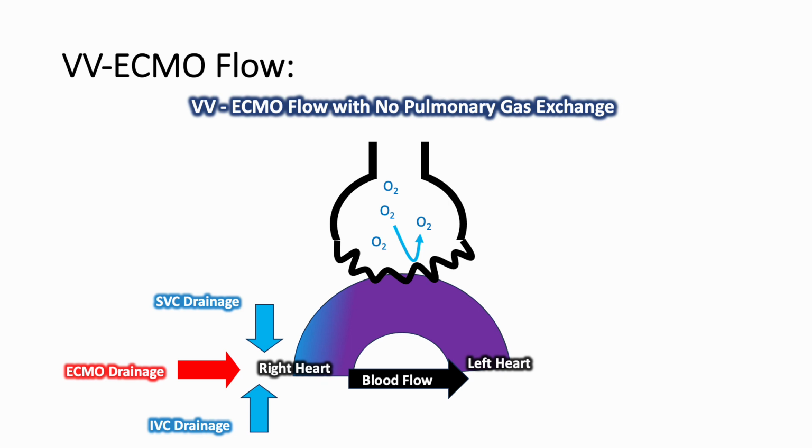And thus that mixture of oxygenated and deoxygenated blood that entered the right heart will essentially remain unchanged and exit the pulmonary circulation, returning to the left heart also unchanged, again existing as that mixture of the two oxygenated and deoxygenated blood. In the end, that mixture will be pumped from the left heart throughout the body, serving as a means to deliver oxygen to the rest of the body, where the lungs are effectively offline related to their severe lung pathology.